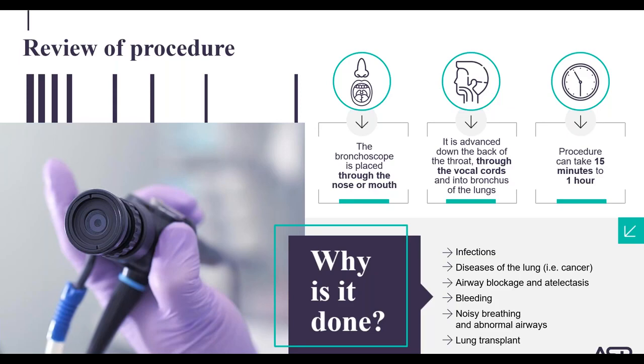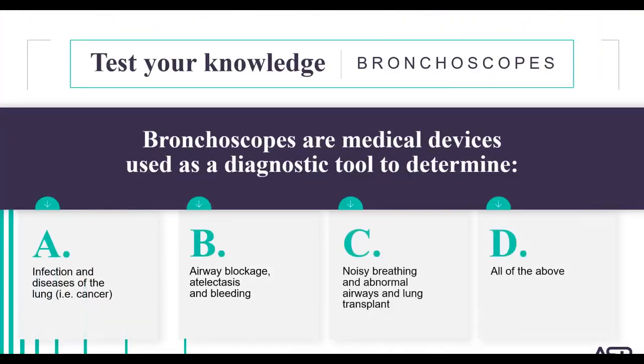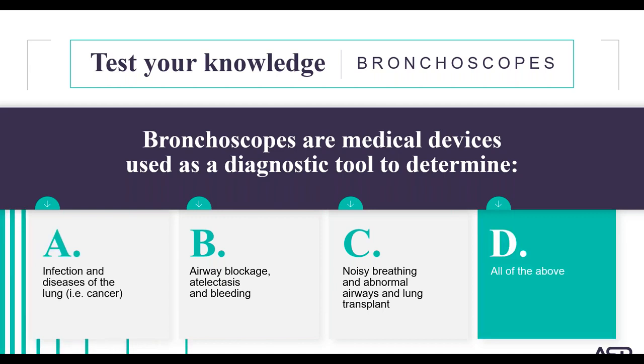So at this time, we want to take a pause and test your knowledge on the information we have shared so far. So your first test your knowledge question is, bronchoscopes are medical devices used as a diagnostic tool to determine, we're going to give you a few moments, read through the answers, and then select the best one. And the answer is D. If you chose D, good for you. A, B, and C are all correct.